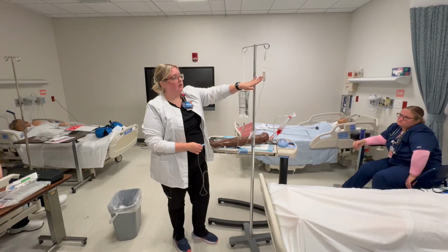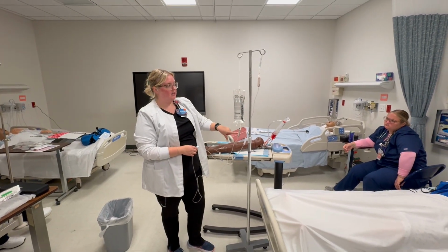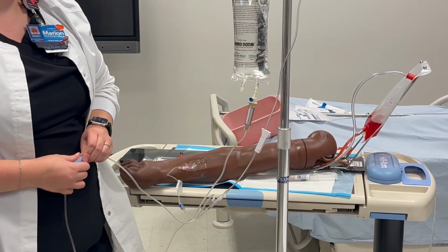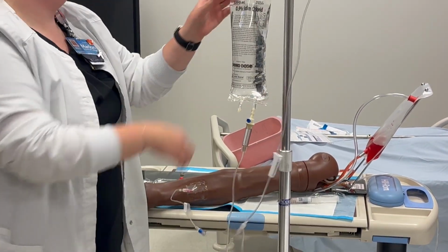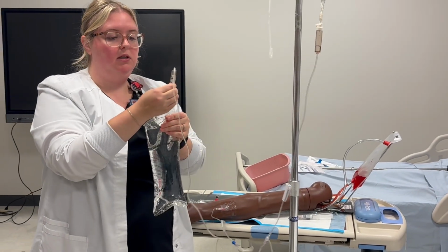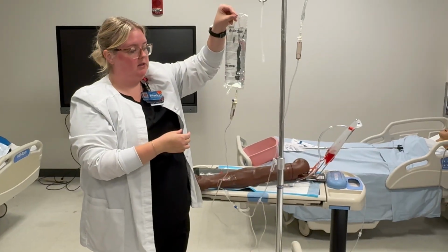This one should be running, this one should not be running, okay? See how this filled up and now I can't see whether or not it's dripping? To fix that, like when you're at home, you take this down, turn it upside down, pinch the drip chamber, and turn it back over, and now it's fixed.